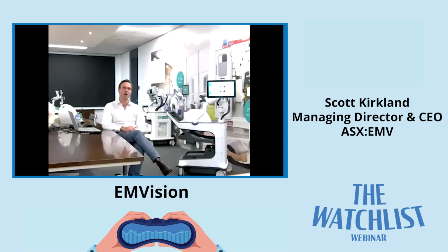But from our perspective as well, we're interested in broadening out our user groups to get feedback on the device, particularly the helmet device. And Robert Tiller, our head of design, has been spending a lot of time with different paramedic groups to go through the workflow, get their feedback on deployment, because ultimately we want them to be able to carry it in a backpack, take it into a patient's home, scan the patient there, and then send the information via telehealth.